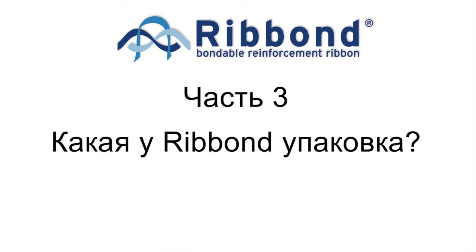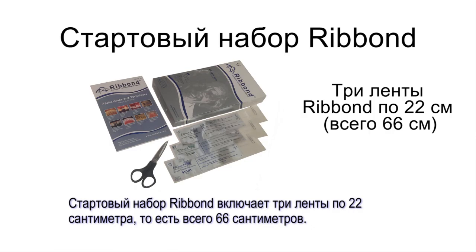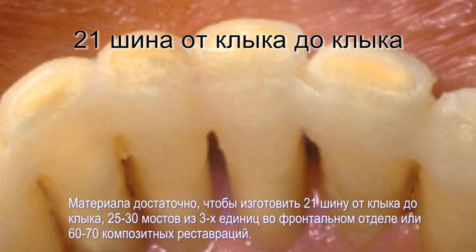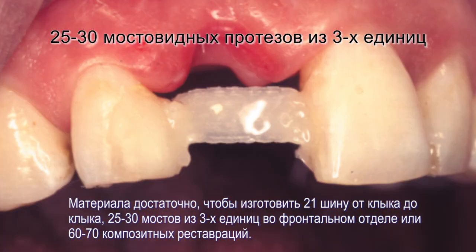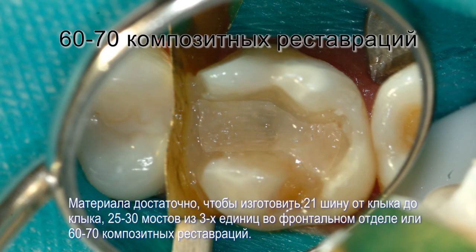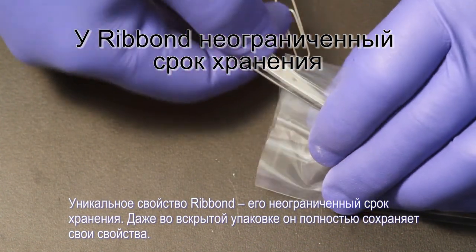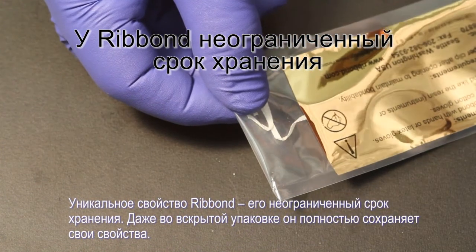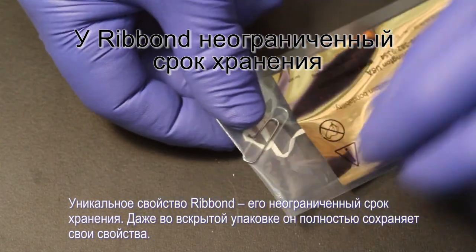How is Ribbond packaged? Ribbond starter kits include three 22cm lengths of material, totaling 66cm. Ribbond is available in 2mm, 3mm, and 4mm widths, and the Ribbond Orthodontic which is 1mm wide. It is enough material to make approximately 21 canine-to-canine periodontal splints, 25–30 single pontic 3-unit lingual bonded anterior bridges, or 60–70 composite restorations. A unique feature of Ribbond is that it has an indefinite shelf life — as long as the material is stored in its protective packaging, it will maintain its bondability indefinitely, even after it is opened.